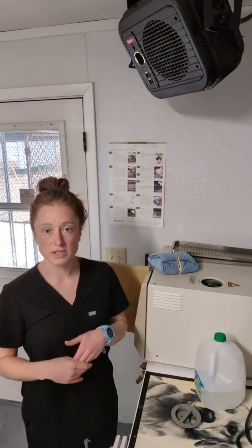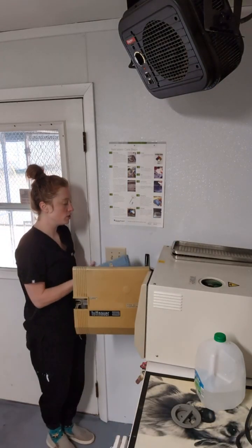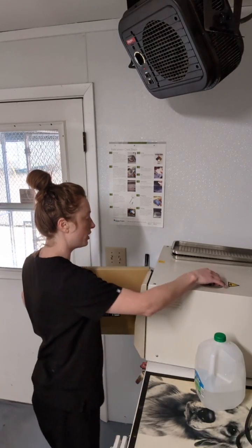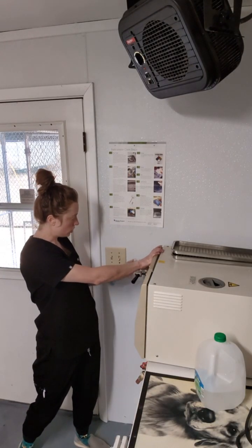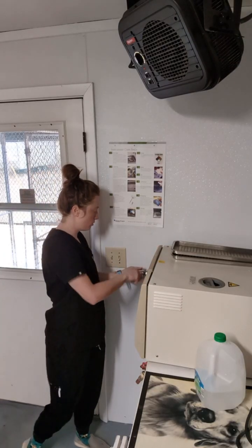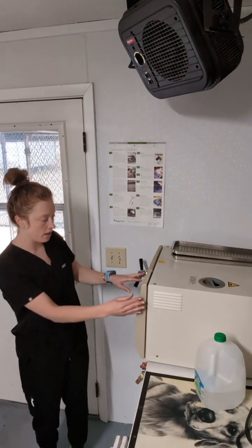Autoclaving works by sterilizing any materials put into it using high pressure steam. So with the pack that I've made, along with any other packs that need sterilization, I will ensure that the autoclave is properly filled with distilled water. It's filled adequately, and I want to close the lid and make sure that it is completely secured. Make sure it's nice and tight. Since it is a high pressure situation, I don't want any of the steam to escape.